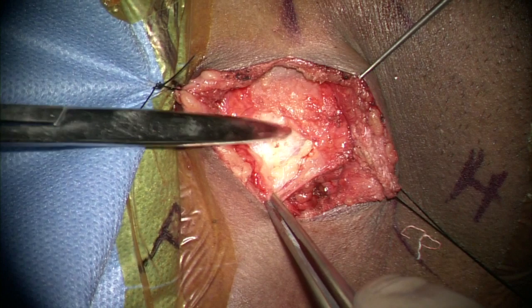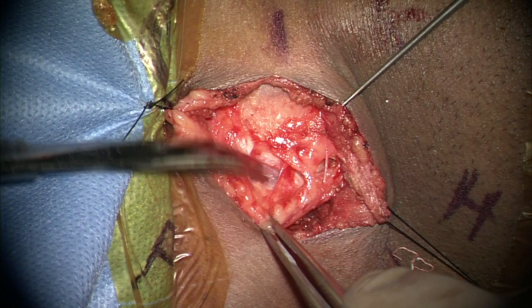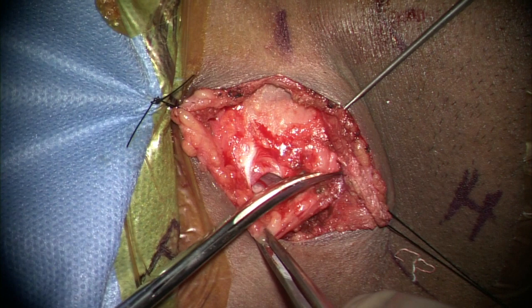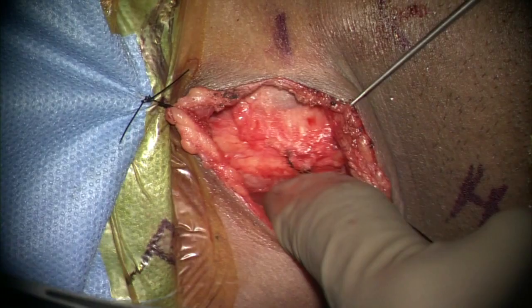The investing layer of the deep cervical fascia is dissected and the aim is to identify the loose areolar tissue on the medial side of the sternocleidomastoid muscle for interfascial dissection. Blood vessels crossing the surgical plane are either ligated or coagulated at this stage. The superior belly of the omohyoid muscle is usually encountered at C6 level and, to help with exposure, can be retracted medially with the trachea or can be divided.